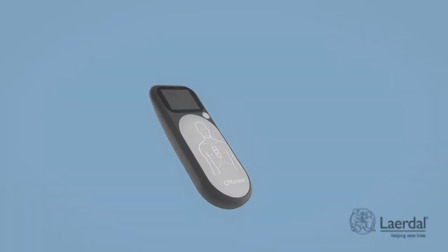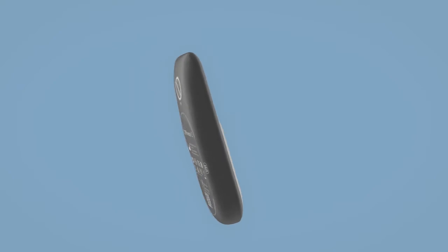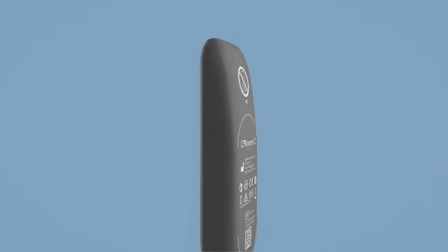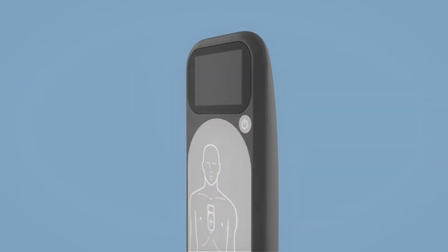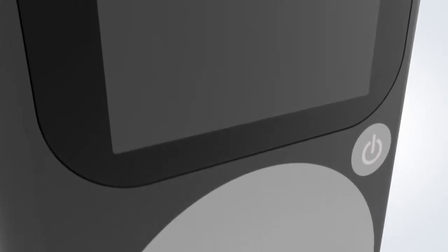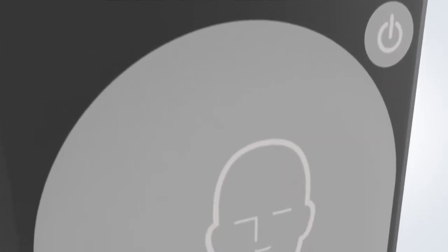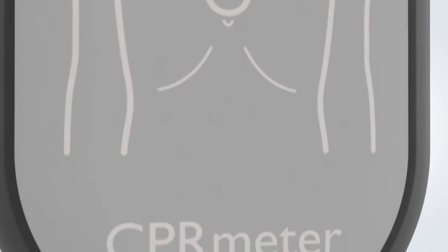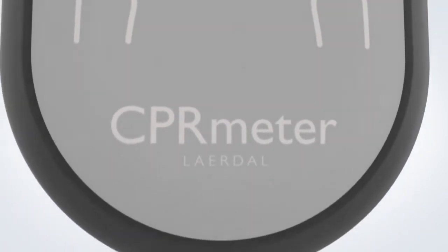It can be challenging to perform CPR correctly in stressful situations. Most of us perform better with support or guidance. The CPR Meter 2 was developed based on this knowledge.